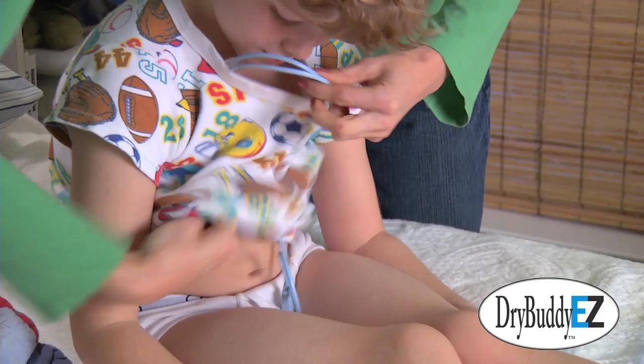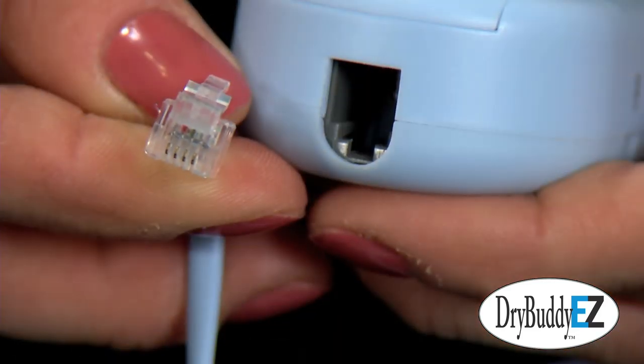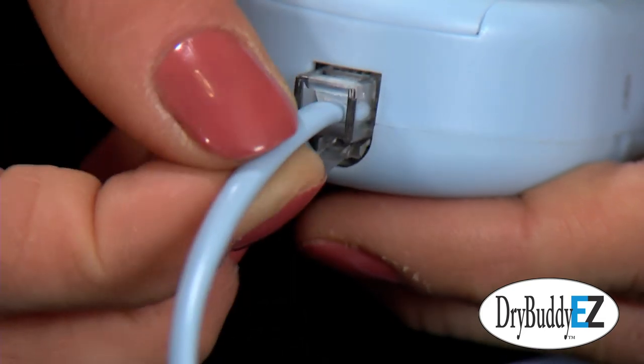The sensor wire would lead up under his pajama shirt and be connected to the alarm. I liked the way the connection of the wire to the alarm was secure and could not come out by itself while David moved in his sleep.